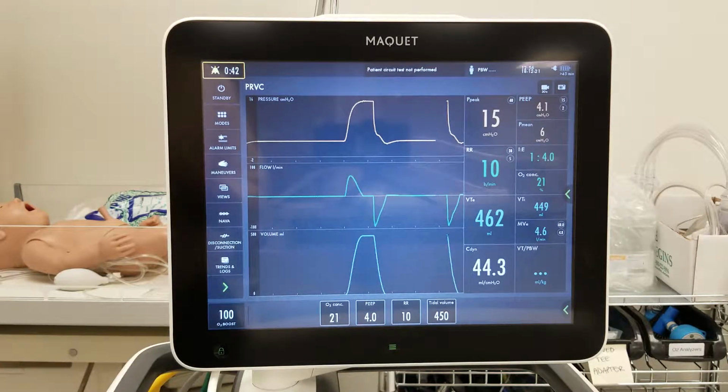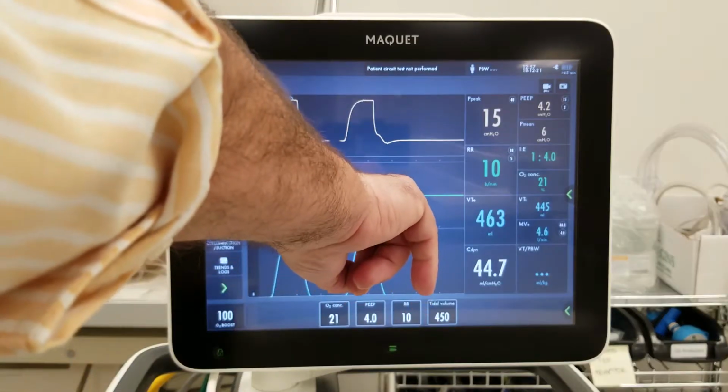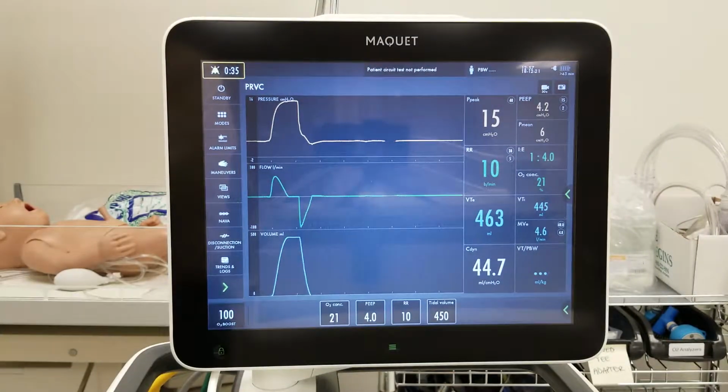Now in this case, we may or may not see that, because what will change is how long we sit at baseline. That's a guarantee. So let's see what happens. We're on a voyage of exploration.